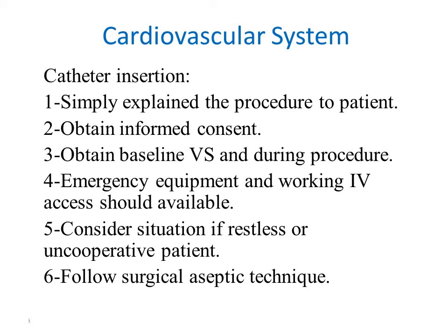Catheter insertion: simply explain the procedure to the patient, obtain informed consent, and obtain baseline vital signs and during the procedure. Emergency equipment and IV access should also be available. Consider sedation if the patient is restless or uncooperative, and follow surgical aseptic technique.